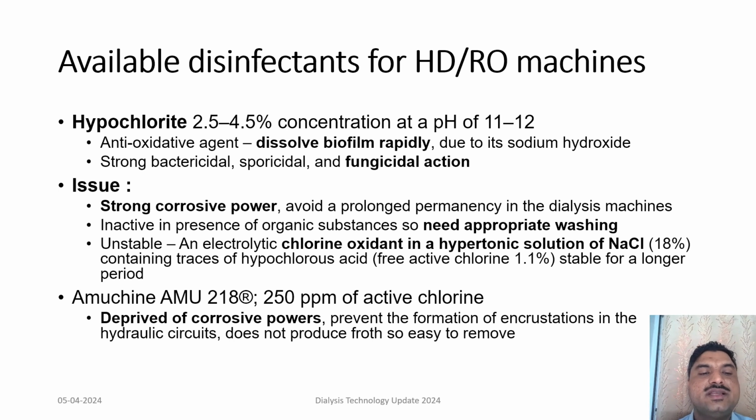The problem with this disinfectant is that it has a strong corrosive power, so it cannot be used for a longer duration or kept in the dialysis machine for a longer duration. And again, it gets inactivated when there is organic substance, so before using it, one must do proper washing. It is also an unstable form.